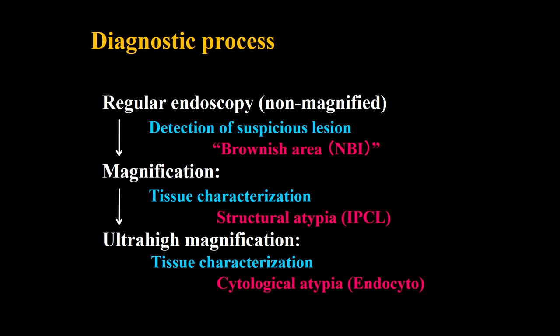This is the diagnostic process: regular endoscopy for detection of the region. Using NBI, we can detect the region as a brownish area. After picking up the region, we perform magnifying endoscopy and evaluate the structure. The indicator is the vascular change. In the near future, there will also be evaluation of cytological atypia.